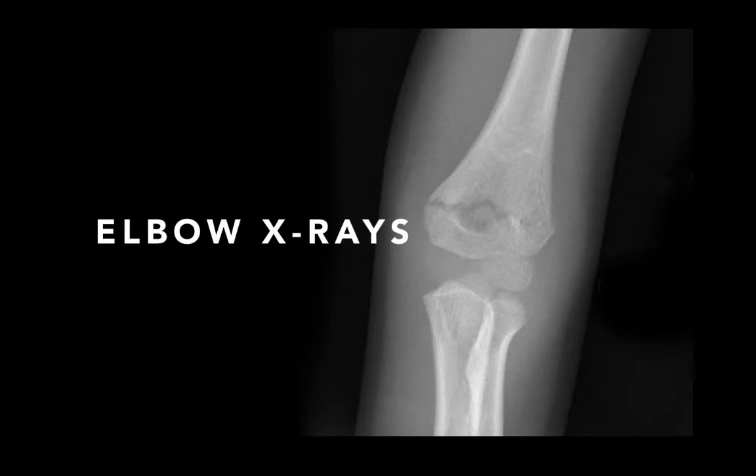Severe injuries of the elbow are usually fairly easy to pick up. This presentation is going to focus on the more subtle X-ray findings so that we don't miss the more subtle injuries that present to an emergency department. This first film is an AP film showing a lucency through the distal humerus, indicating a fracture.